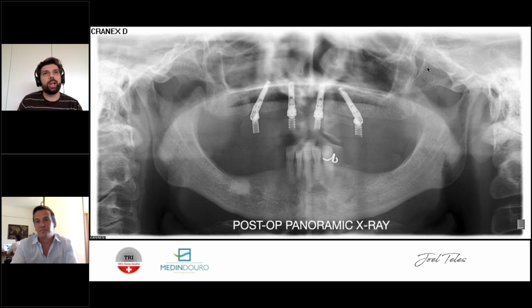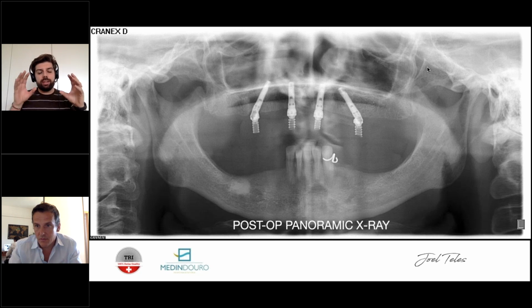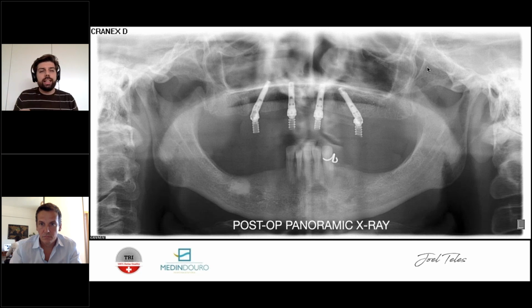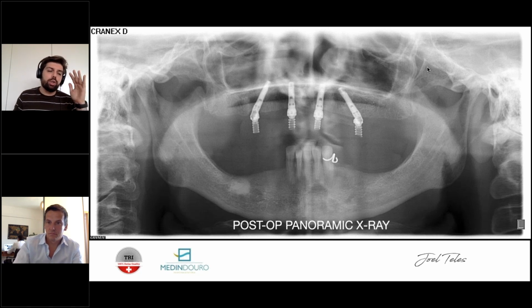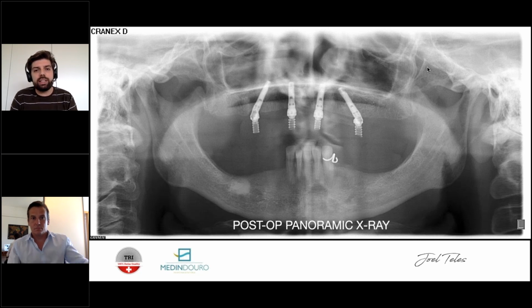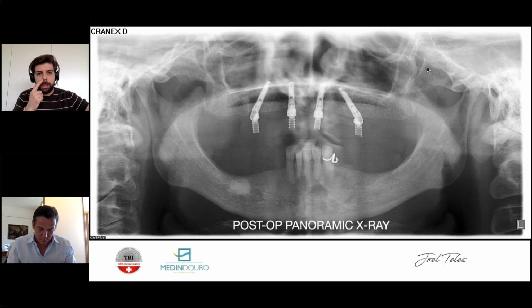I will not tell you absolutely not, because I've used it, but it's not something that is described. And normally, remember, in a single crown, you need to think about the restoration you're doing and where the screw is coming out on the restoration. Otherwise, you'll end up with a restoration here and your implant here. You understand what I'm saying? And this will not work. So it can be useful to avoid some situations with small bridges, and then you do the grafting anyhow, to keep everything in place. It may help you to compromise a little bit where the screw is coming out, if you have the feeling that you will find better bone and therefore better long-term solutions. But this is particularly for full arch approaches. Okay.